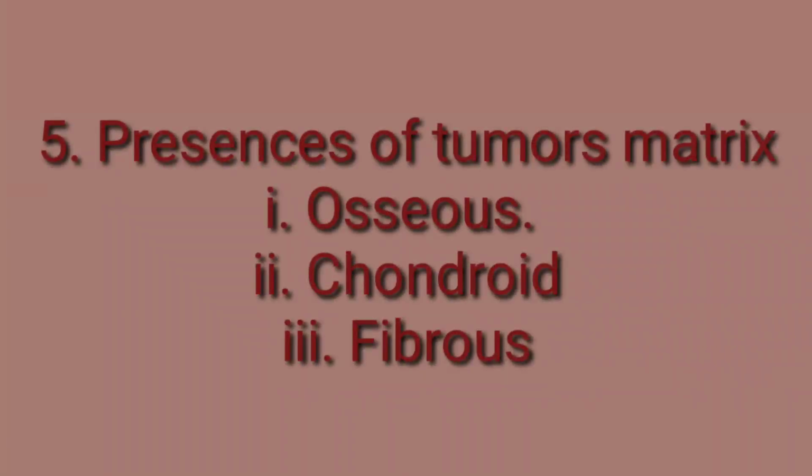A very important and worth-noting point is that one should look for the presence of tumor matrix.